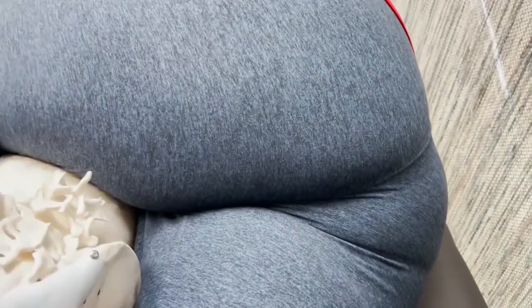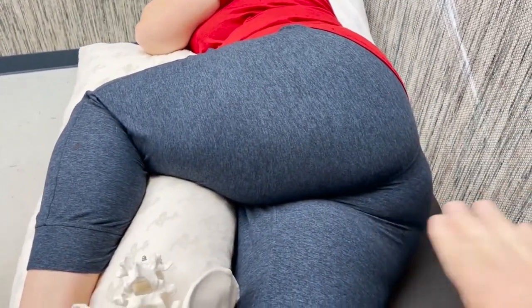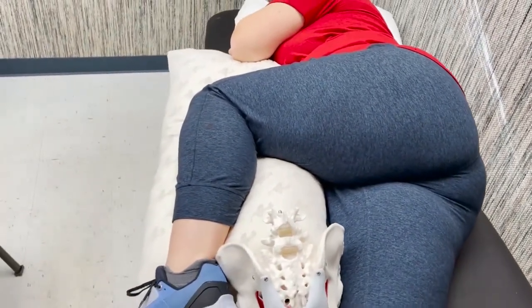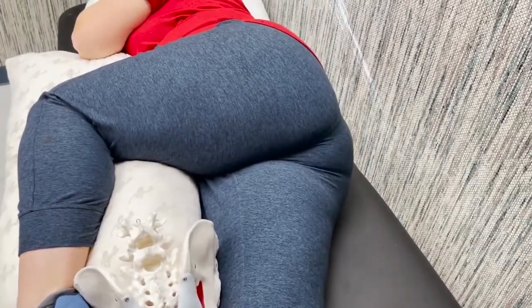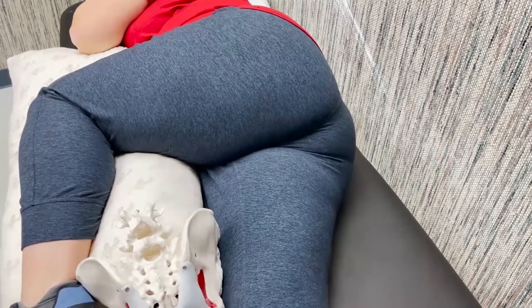So very frequently we are going to deal with, more often than not, both the mat side as well as the sky side. So treatment side is always going to be the mat side surface here. And to go bilaterally, quite honestly, all we're going to do is flip to the other side, position in the same orientation, and then we can treat the other side of the pelvic floor as well. So great positioning for dry needling of the pelvic floor.